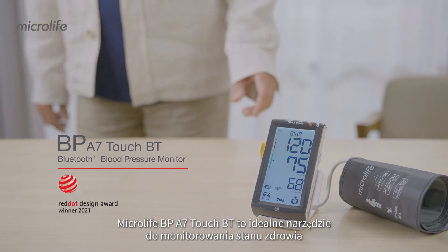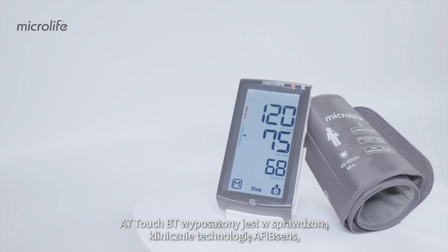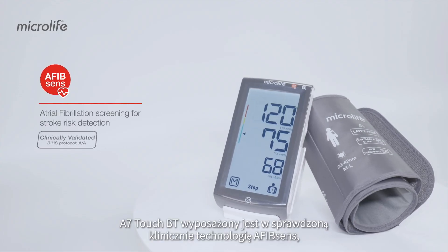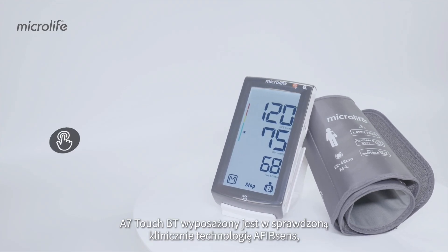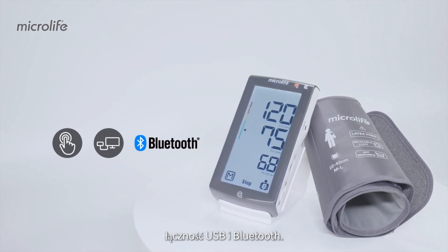Microlife BP-A7TouchBT is the ideal tool to monitor your health. The A7TouchBT features the clinically proven AFibSense technology, user-friendly touchscreen, and USB and Bluetooth data connectivity.